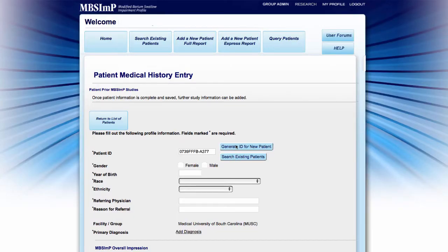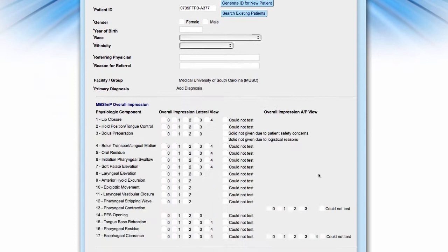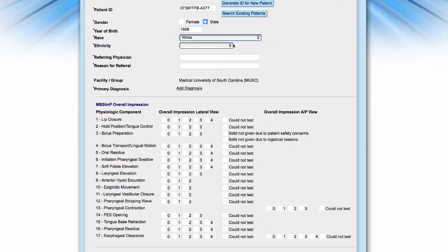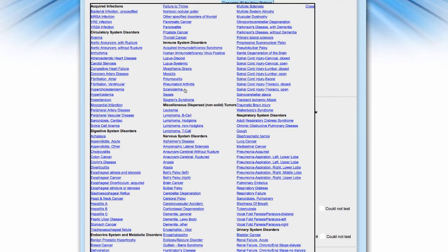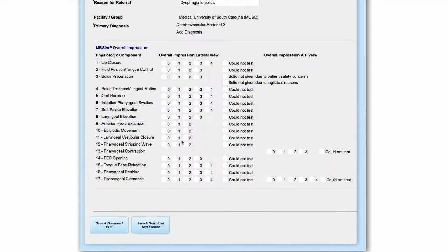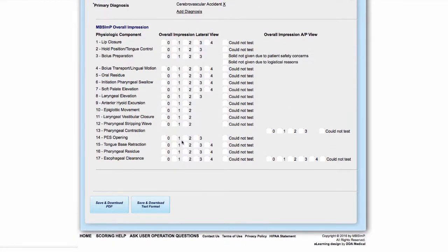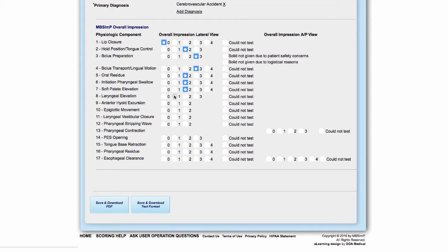Once an ID is obtained, the patient's year of birth, race, ethnicity, referring physician, reason for referral, primary medical diagnosis, and MBS IMP overall impression scores must be entered before a report can be generated.